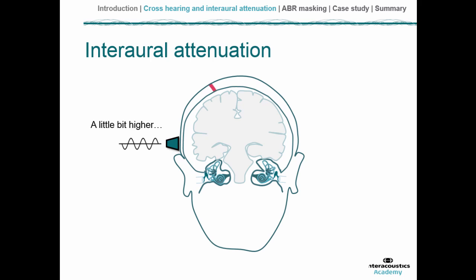But an increase again, and it might be that the sound vibrations pass all the way over, and in this case the vibrations are said to exceed the interaural attenuation. Now I've shown this example with the bone vibrator, and since sounds crossing from one side of the head to the other primarily do that via the vibrations of the skull, as I've mentioned, you might not expect the sound level to be very high before the interaural attenuation is exceeded.